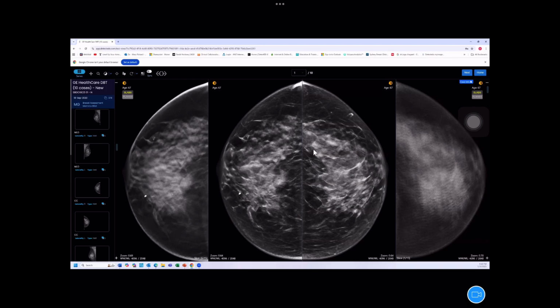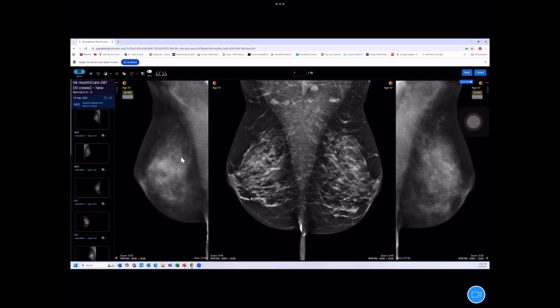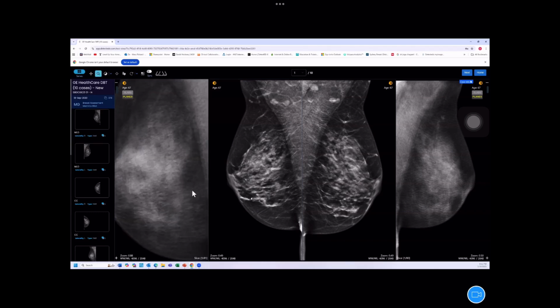We'll go on to the next view, and we'll have a look here. Maybe in this particular case, I'll look at it in the individual slices, the planes. We'll just have to wait while it loads up. The individual slices, or planes, actually give you greater detail. The slabs are where we've put 4 or 5 slices together. So let's have a look at this one. To make it a little clearer, I might zoom this area up for you, and then we'll go through the slices one by one.